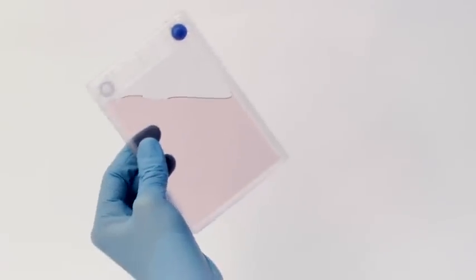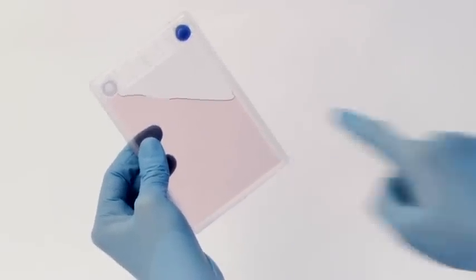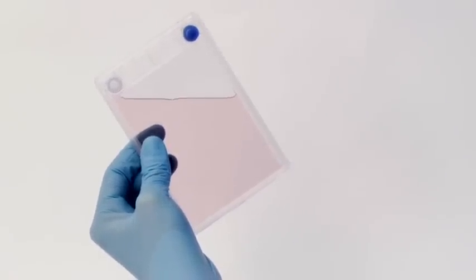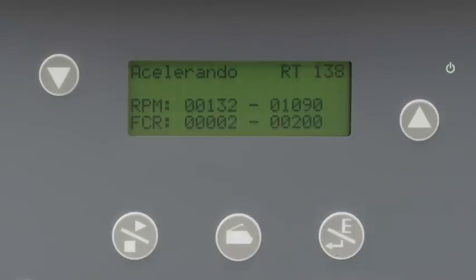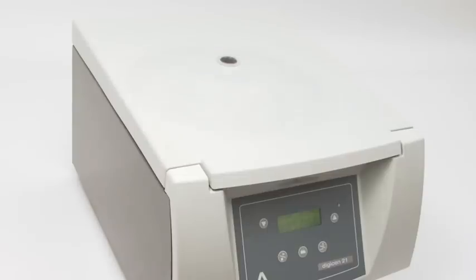To pellet the cells in the bottom right-hand corner, the pitaka should be positioned in the centrifuge with the port at the uppermost corner. Introduce the pitaka into the centrifuge rotor pocket in this way. Set the desired speed and time and begin centrifuging.